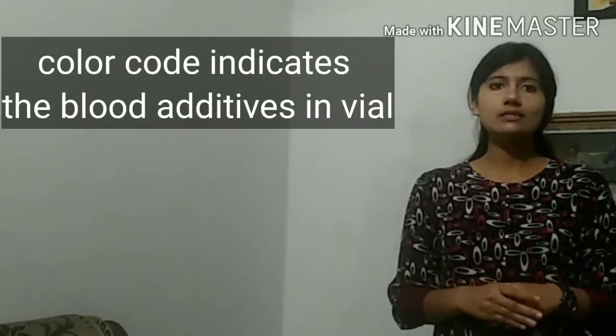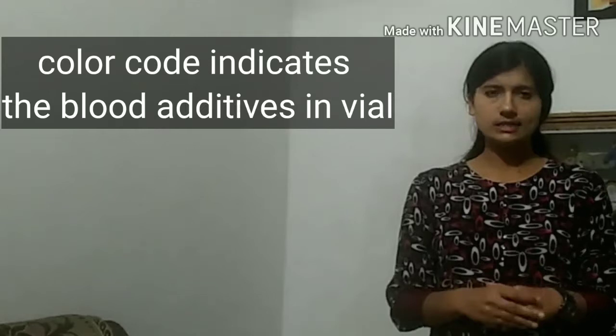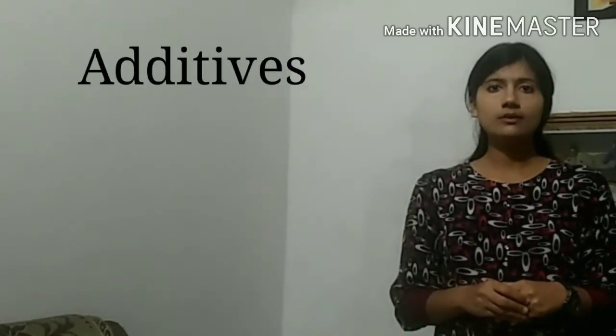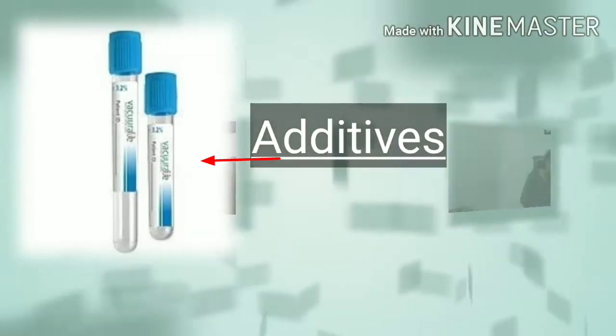The color code indicates the blood additives the tube contains. Here, additives are chemical substances that preserve the blood for processing in the laboratory. It means the new vial which we see is not totally empty but it contains the additives. Moving on to the first color coded, gray vial.